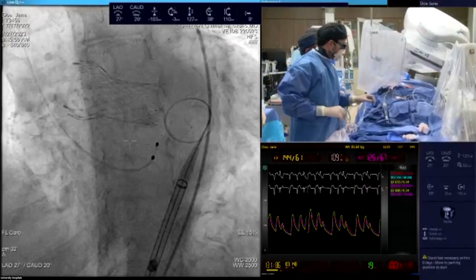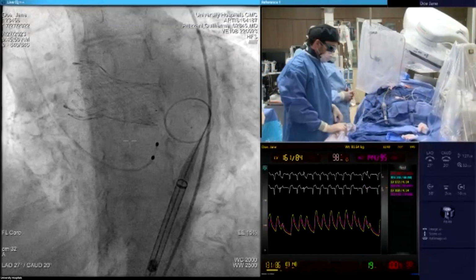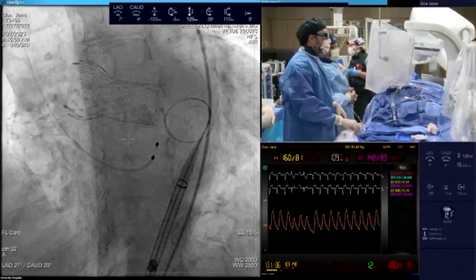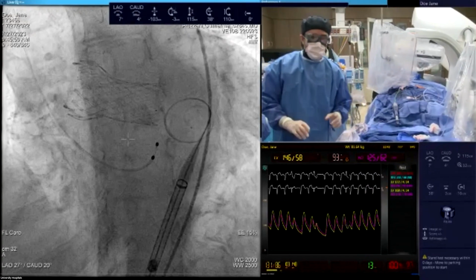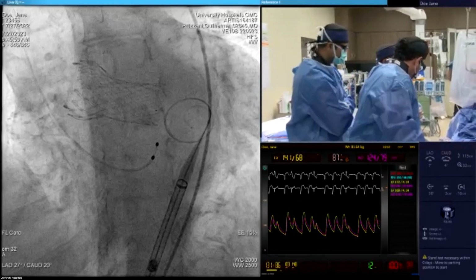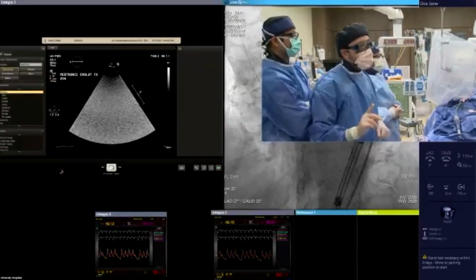The left came up a little bit as it followed the aorta, because of the crown portion, it has to follow the track of the aorta. So at whatever point, the valve is going to rotate. And so most often it does come up on the left. Yeah. So I think I was going to make a comment here.